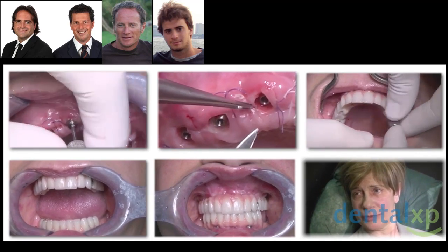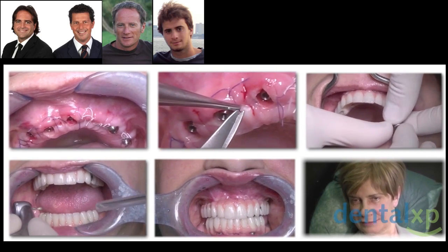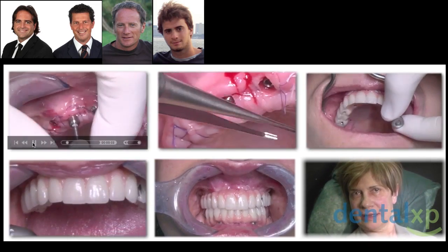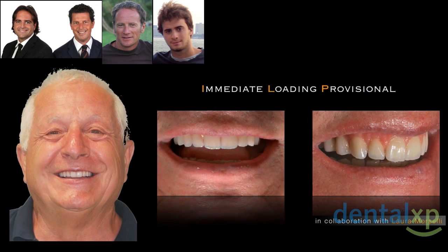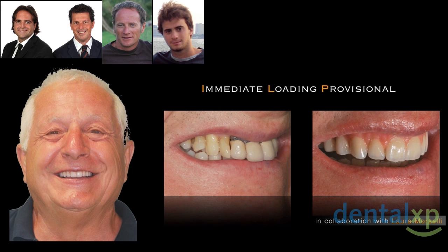We try the function, but what I want you to focus on in this slide is the face of the patient — you can see there is no swelling, she did not have any pain, and she is happy with this provisional restoration. On the right side, the balance compared to the initial situation is much better — the white and the pink balance — and Armando is much happier than at the beginning with this temporary in place.